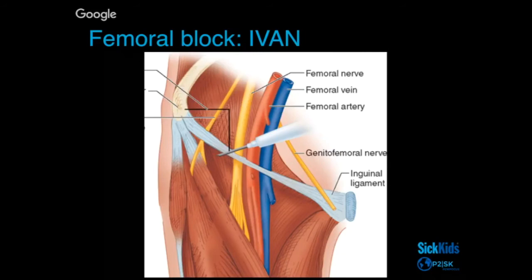So the nerve is the most lateral structure. And what is important to know is that if you look at the anatomy here, the nerve is a round structure, kind of in the cephalic area, but then it becomes a lot of different bundles. And the artery does exactly the same thing, not as many bundles, just two, but still. So keep that in mind. If you see only one artery, great, you're at a great location. If you see two arteries, just move cephalic a little bit so that you can catch just one femoral artery and not the two. And that's where you should be injecting.